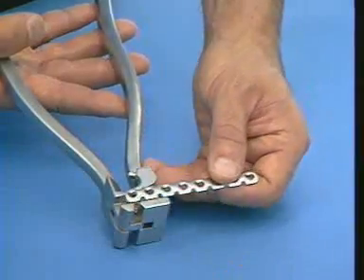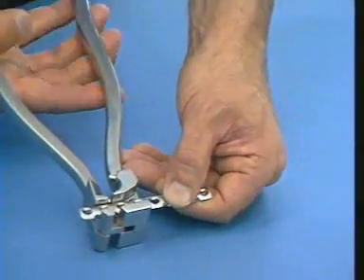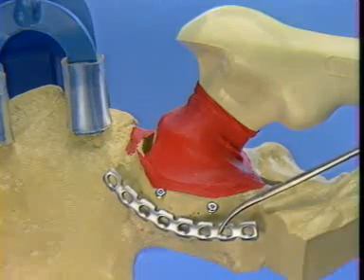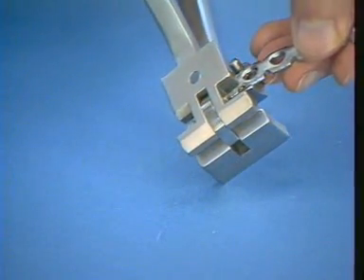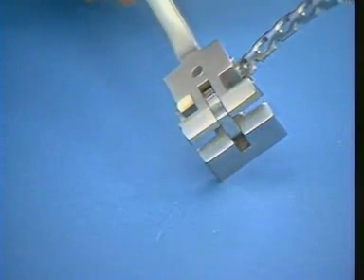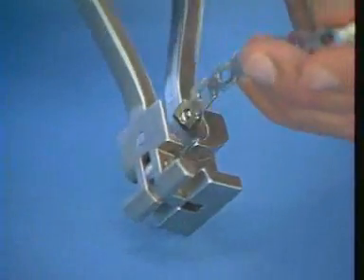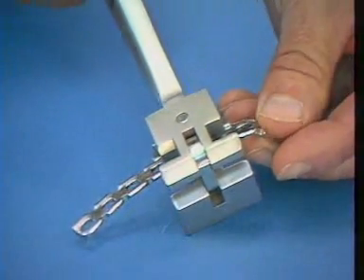The first step in plate bending is to bend a plate on edge and establish its curve. This curve should roughly parallel the rim of the acetabulum. The concave and convex contours of the plate are then bent in the normal manner using the reconstruction plate bender. Multiple small bends in the plate establish a smooth, rounded contour.